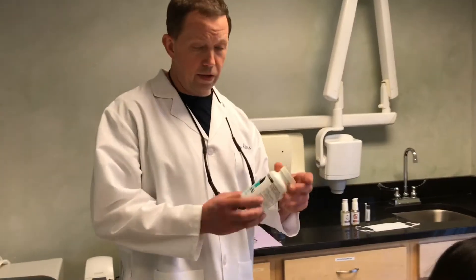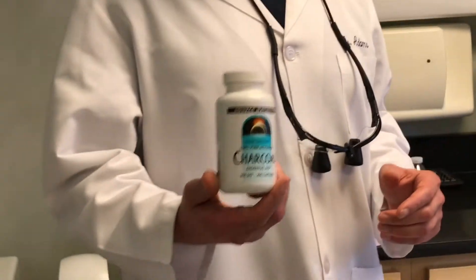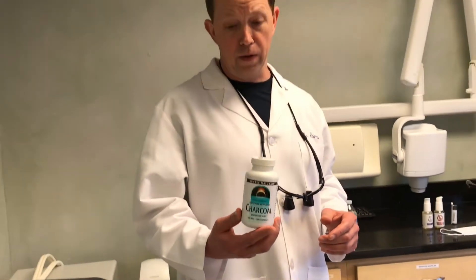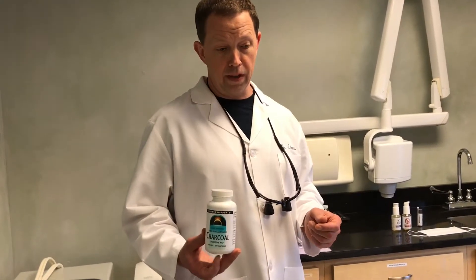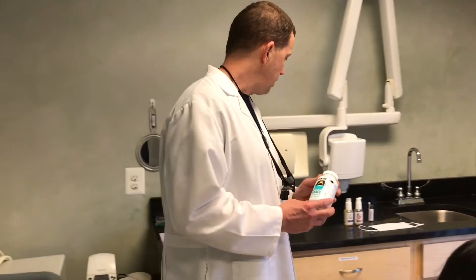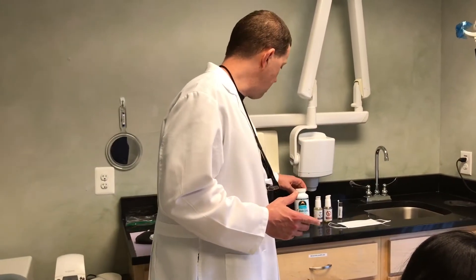This is activated charcoal capsules. We always give the patient one charcoal capsule before we take out any amalgam fillings. It's basically a binding agent, so it'll grab on to any mercury that's released that happens to make its way into the stomach, and it'll enable the person to pass it out rather than have it absorbed. It's a good, helpful safety mechanism.